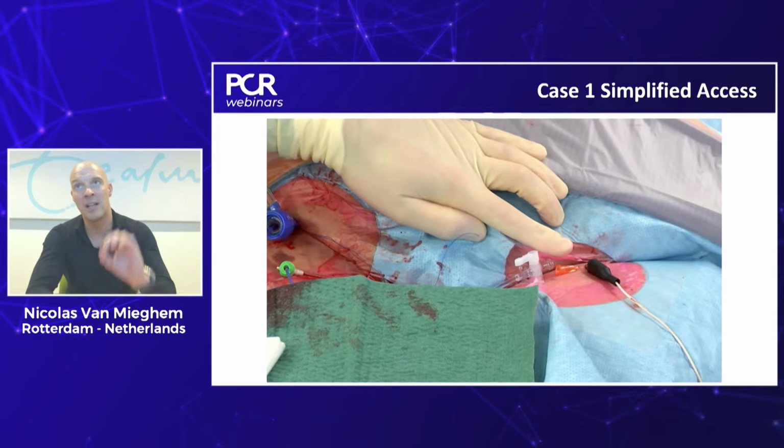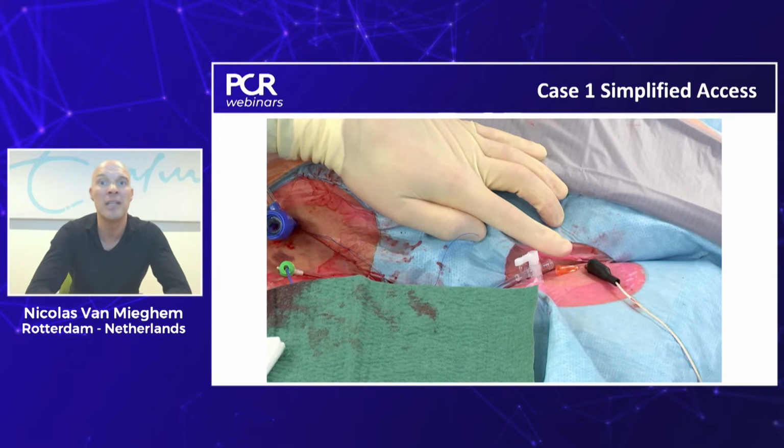On the left side, we just pierce the skin with a needle that will help us for LV pacing when we do balloon dilatation during this procedure. So that is basically our simplified, minimalistic, if you will, access approach.